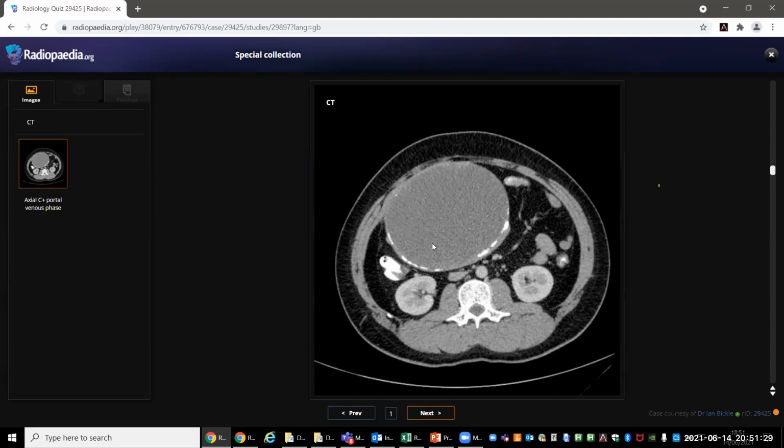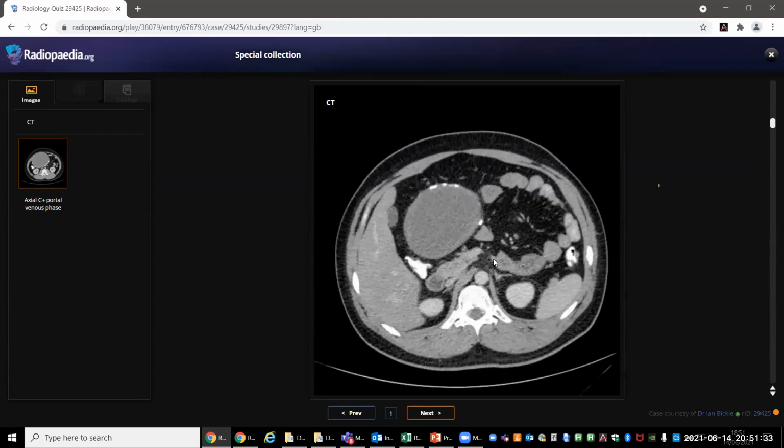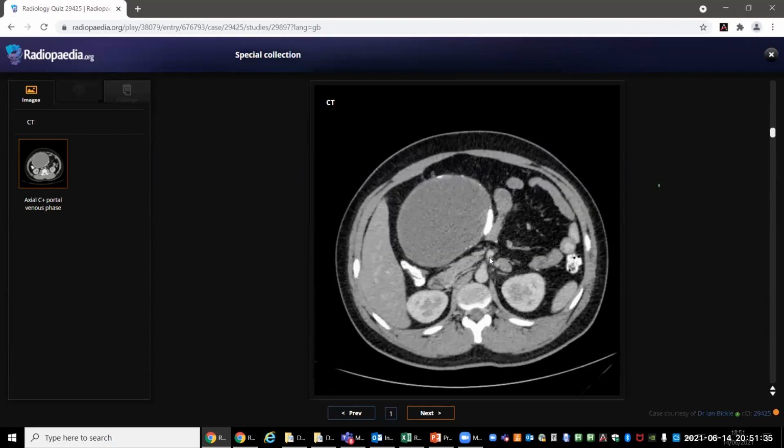Even though it's clearly mesenteric, you didn't mention trying to be sure that it's clear of the pancreas and rule out other differentials. And yes, you should be able to. There's no worrying feature in the cyst, so you shouldn't be afraid to do an ultrasound and possibly drain it, not just for cytology, really.